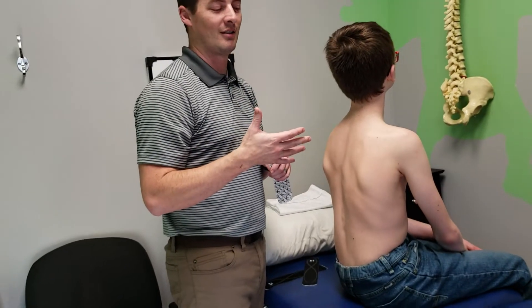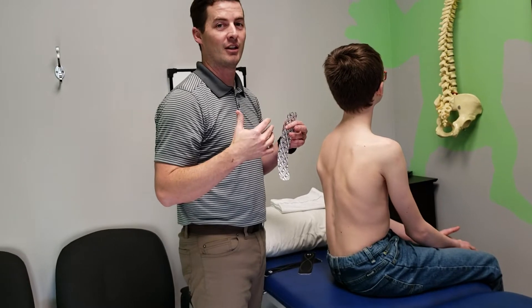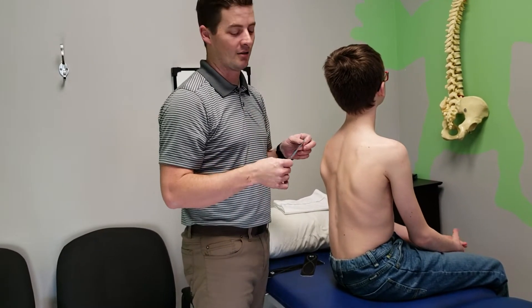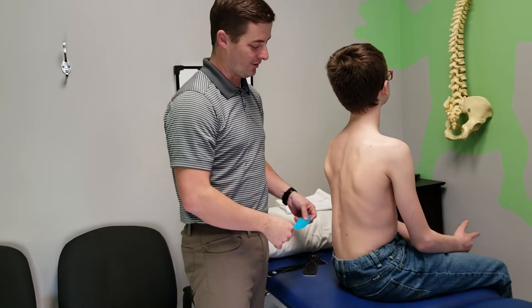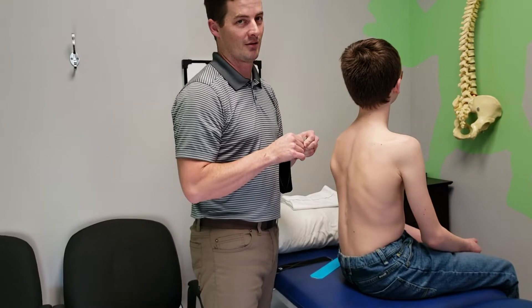Taping for scoliosis and posture. We do a lot of posture taping to try and encourage posture to stay more upright, to add a reminder. So this is not going to stop you from slouching — this is just a reminder taping.